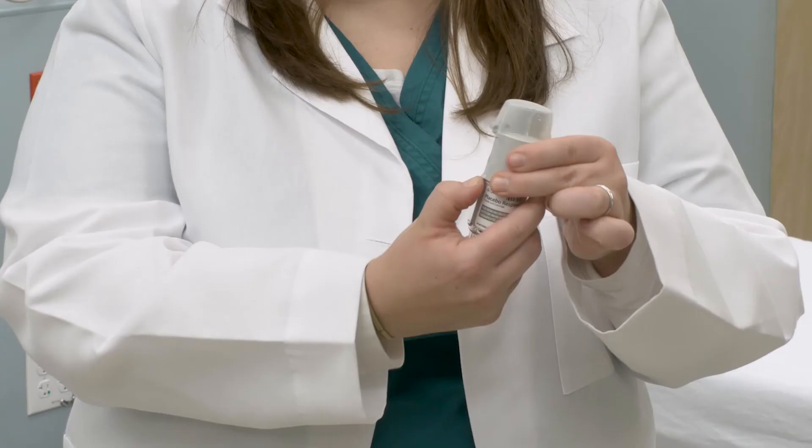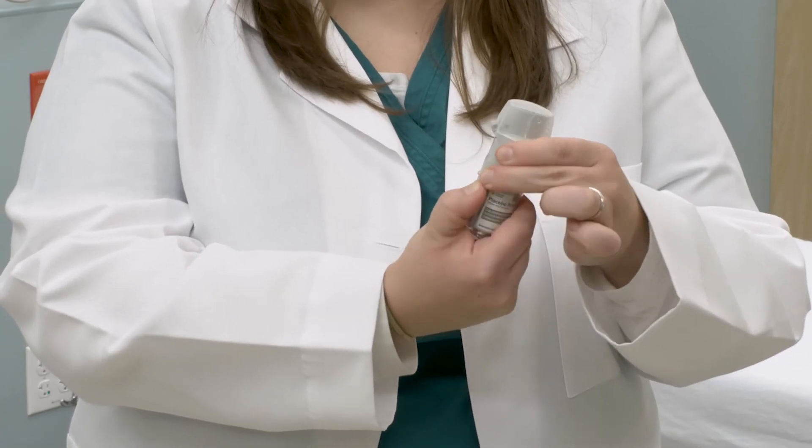You'll want to hold the Respimat device upright and turn the base of the Respimat. The audible click you hear will indicate that the dose has been loaded.